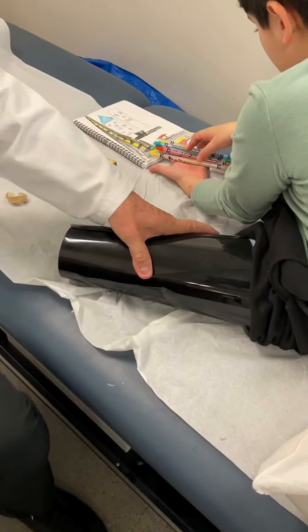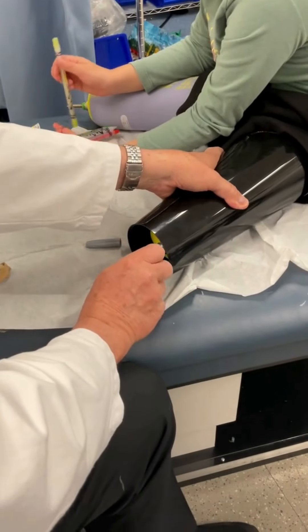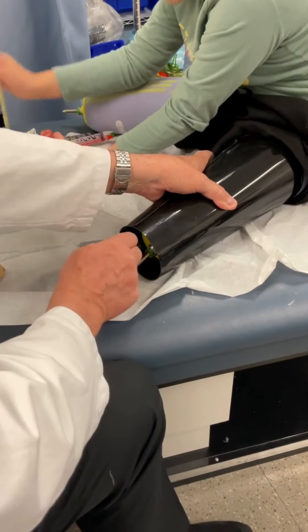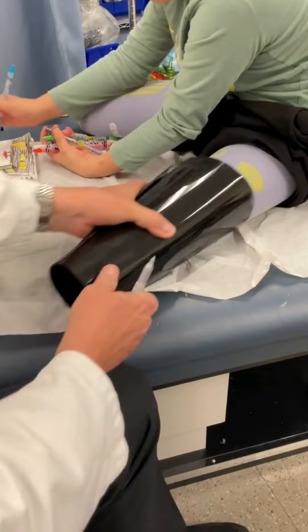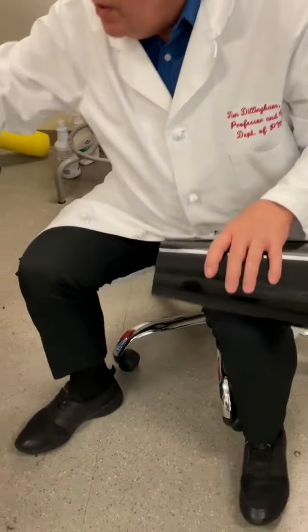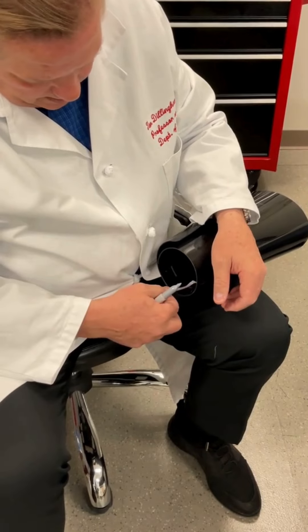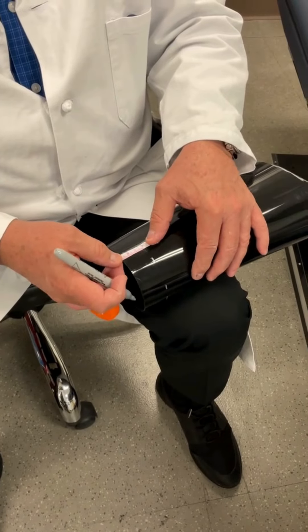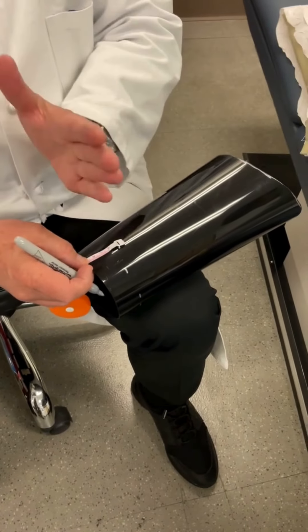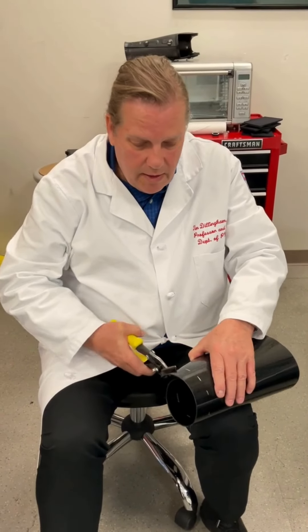It seems to fit pretty nicely. So then, right here on the inside, you simply mark how long you want to cut, and about right there where it's at. Then you measure that mark that you had, how far it was — it's about three centimeters. First you've cut the top, now you'll cut the bottom.